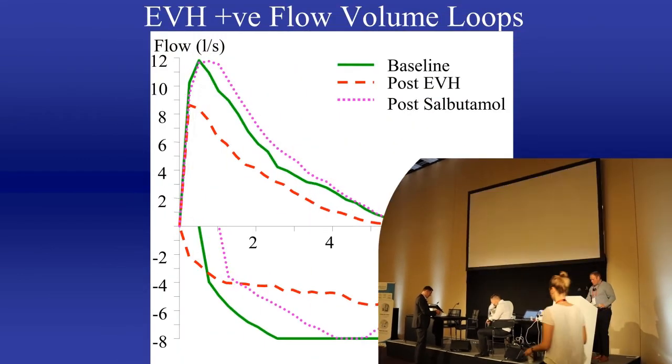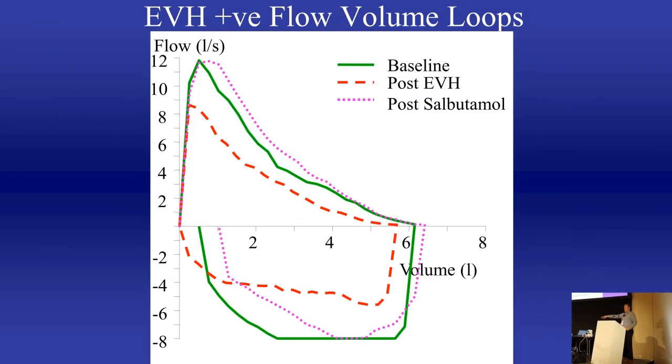Excellent. So whilst we wait, you can see here Benjamin's got a bit of a post-test cough. That's quite normal. The person's likely to have a dry throat for up to 30 minutes or so after the test, but that's about all the side effects you might experience. If you've got someone with EIB, they might report a tight chest or that it's harder to breathe. But as long as they sit nice and relaxed in the chair, we just need to wait for 3 minutes and 5 minutes to capture this drop of 10% in FEV1.